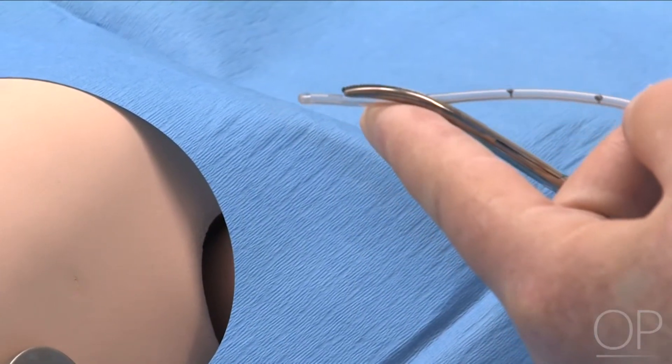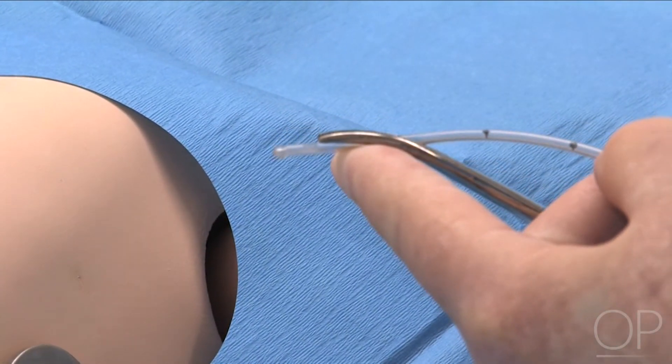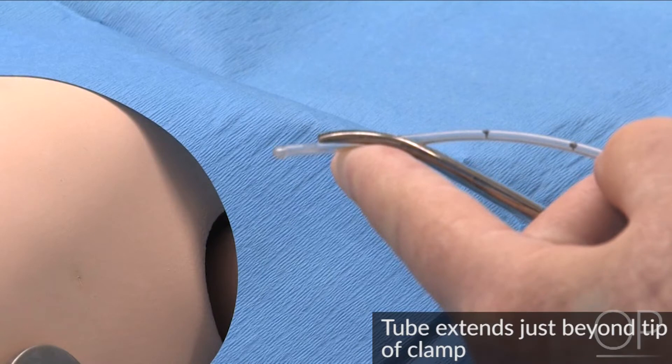Attach the Kelly Clamp to the distal end of the chest tube, allowing the chest tube to extend just beyond the tip of the clamp. Trocar should not be used.